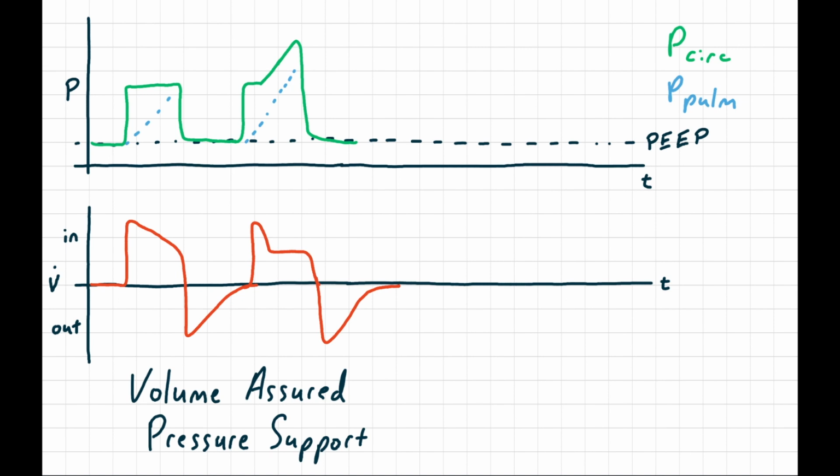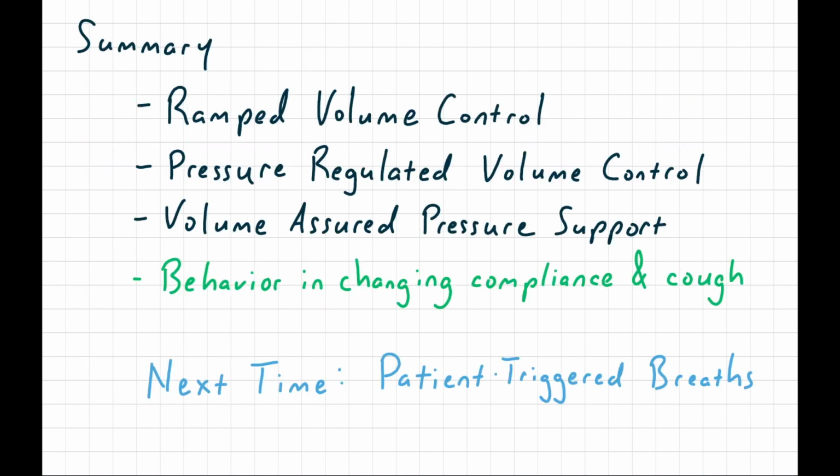I'm showing you this mode not because it's particularly common in the hospital, but just to demonstrate one more way that a ventilator can try to get the best of both in terms of a pressure control shaped breath with a guaranteed tidal volume. So to summarize, this time we looked at 3 strategies to combine the best features of pressure control mode and volume control mode.